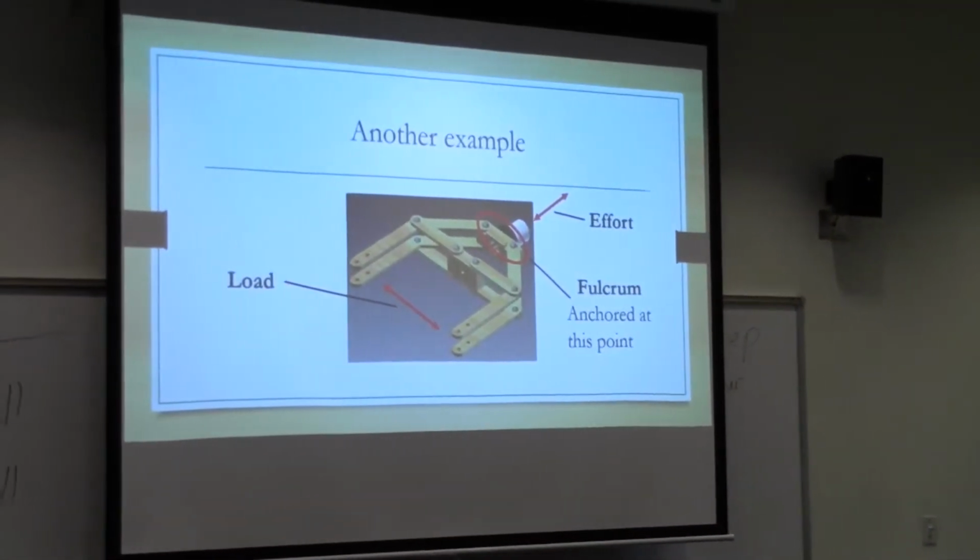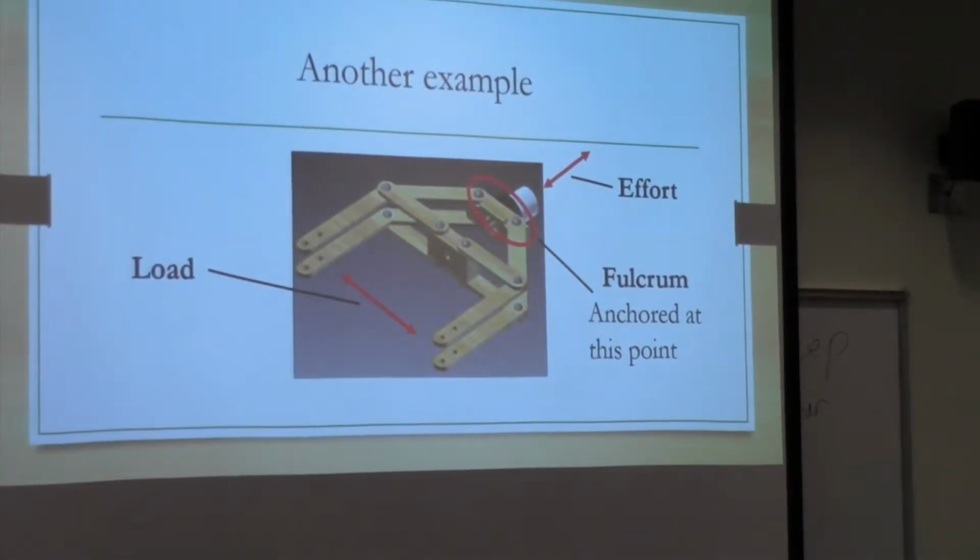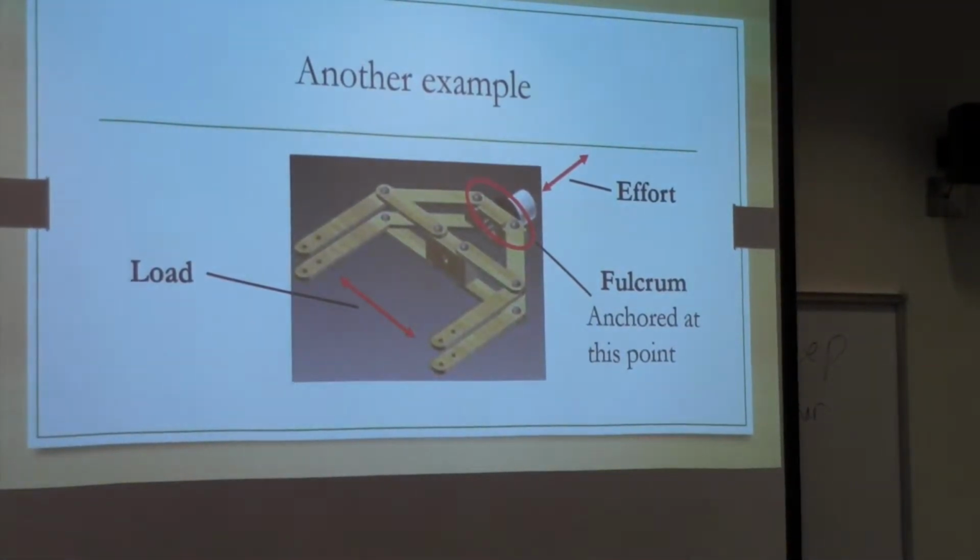Here's another example. It's very similar to this. I ended up using the two levers here to make it stronger, because it was strong in one direction. So if I was trying to pick something up, it was strong enough to grip it. But when you try to lift it, especially with the cardboard, it wasn't strong enough in this direction. So something that worked out for this one is just adding another layer of wood right here. So it has 2 layers, kind of like this one does.